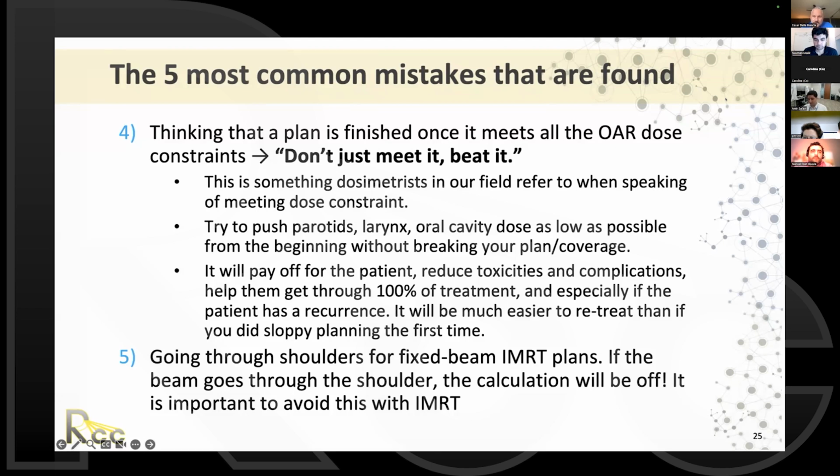I completely agree with Dr. Malik, and one modification that I made personally to CB CHOP in the last year or so has been to expand the acronym for myself to FILM CB CHOP. So when you're evaluating the plan, look at the fusion, right? The contours may look perfect on the planning CT based on some assumptions, but if the fusion with the PET or the MRI that you have used to contour is not necessarily right, you could be missing your disease that's clinically apparent. As Dr. Malik said, patient identification, the laterality in some cases, and then the medical history, going back and forth to the operative note, to the physical exam.